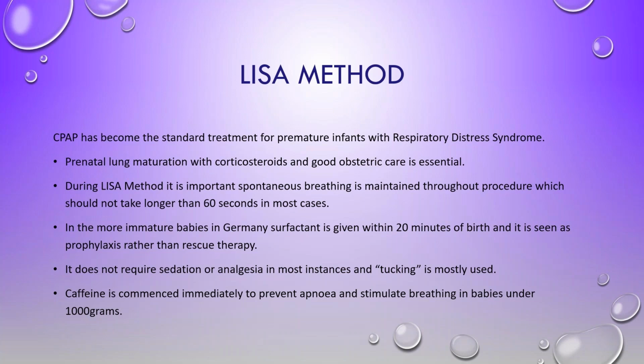The LISA method also does not require sedation or analgesia, and in most instances, they only tuck the baby. By tucking the baby, flexing the baby in, what you will see is that the baby actually takes to this method quite well. Also, at that stage, there's probably enough epinephrine or adrenaline on board that the pain factor is not that considerable if it's given within the 20 minutes.